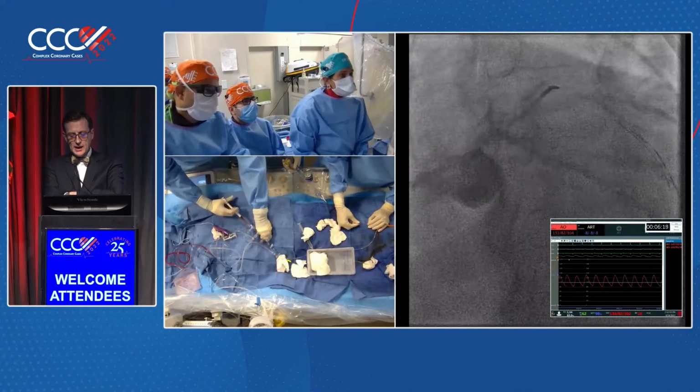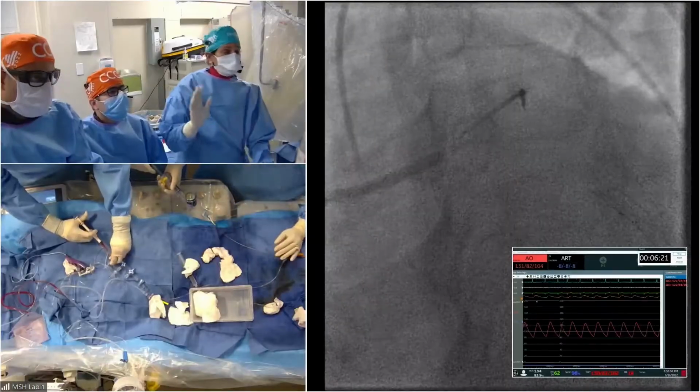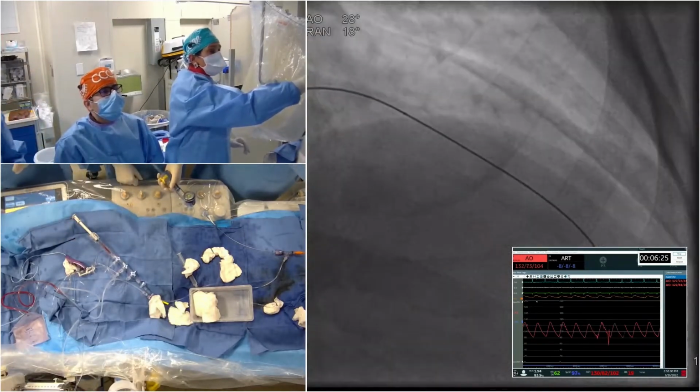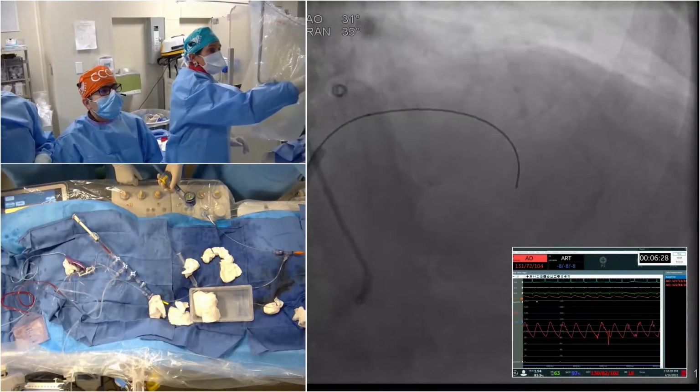Dr. Kinney, hello. Good? Yeah, we are good. Oh, you see us? Okay, good. You went away and we recrossed. So remember, we changed our strategy. We pulled back.